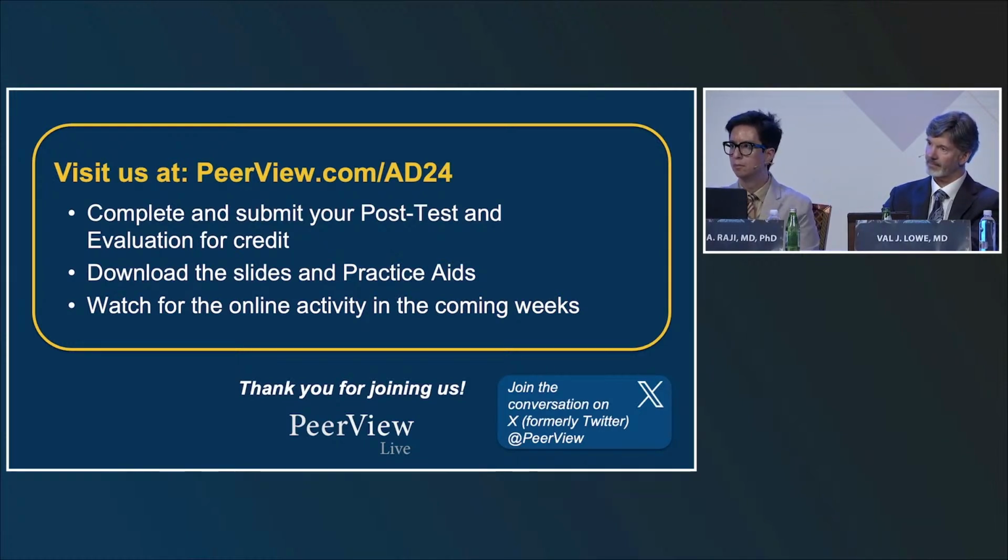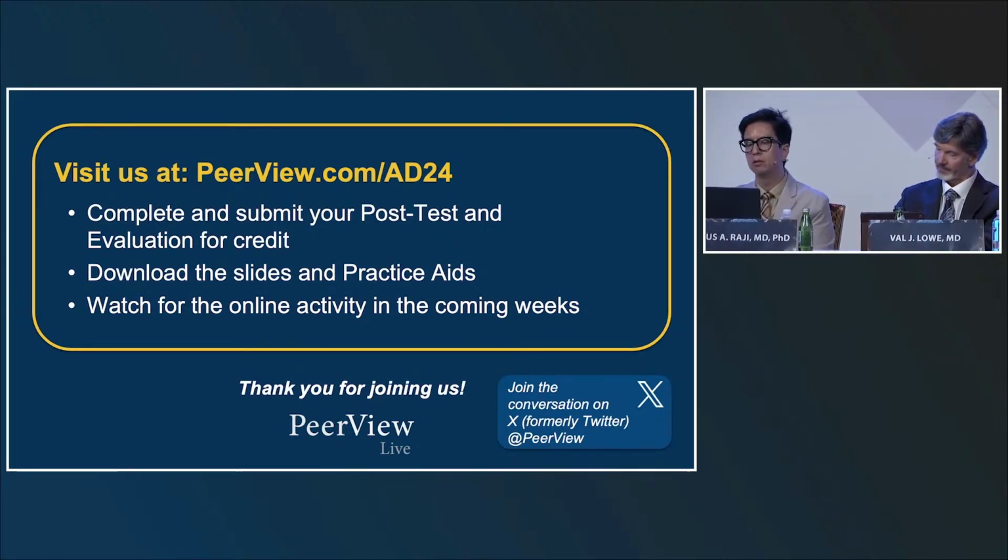Question on the left here. So we have this plaque and tangle conference, which is like a tumor board for these cases. And something that often arises is this concept of a Fazekas 2.5. I don't think the Fazekas scale was ever meant to be used in this way. Some folks feel comfortable treating with severe small vessel disease. How we define that is sort of unclear. I think it would be better to use white matter hyperintensity volume, but how do you all deal with this issue?